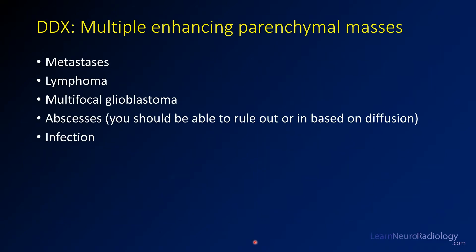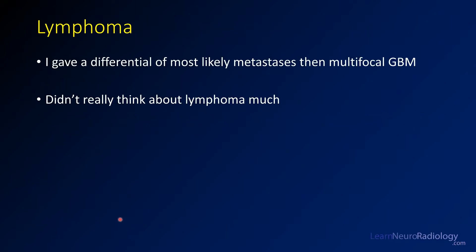With multiple enhancing masses, think about your differential: similar to before, but you're upgrading metastasis and lymphoma as top considerations, along with GBM. This turned out to be a case of lymphoma. When I was reading this case, I read it as metastasis and multifocal GBM — I didn't really think about lymphoma because it was multifocal and had some central areas of necrosis.